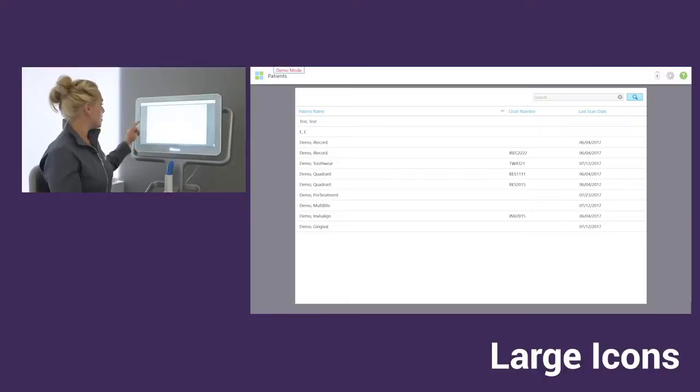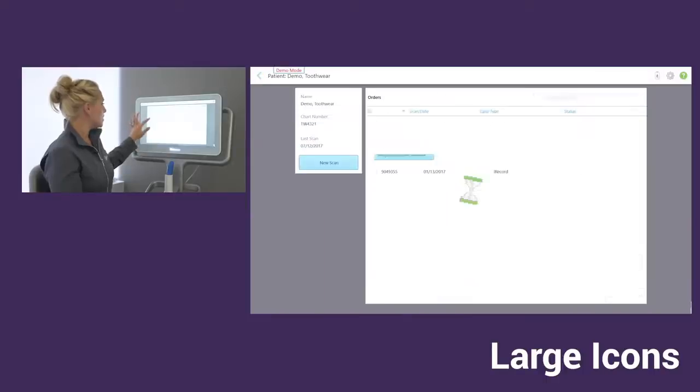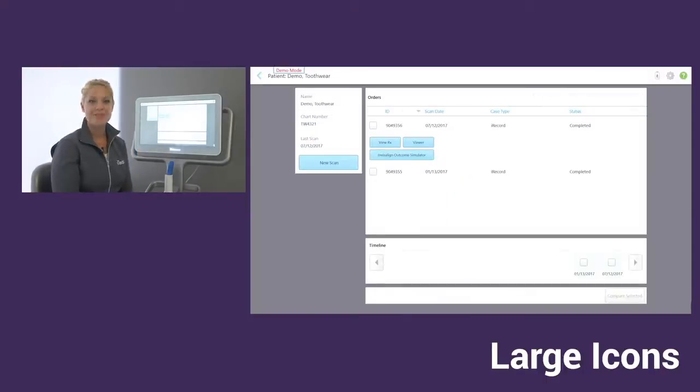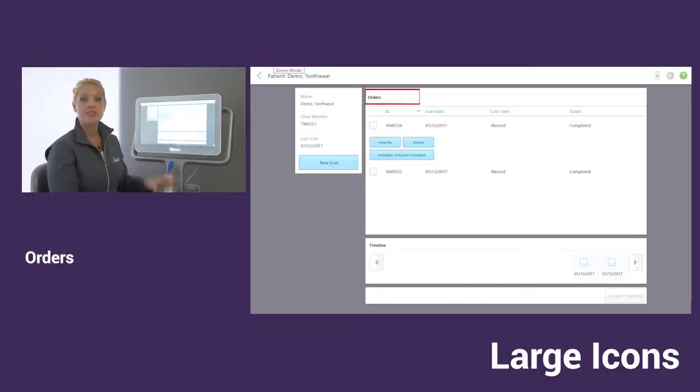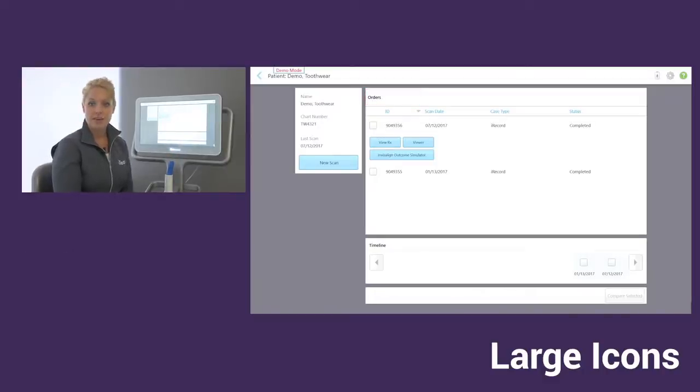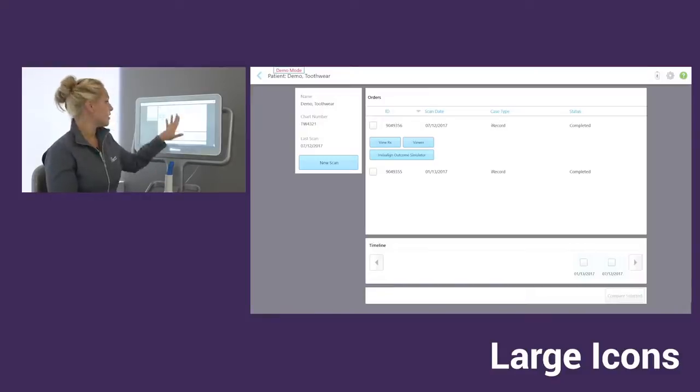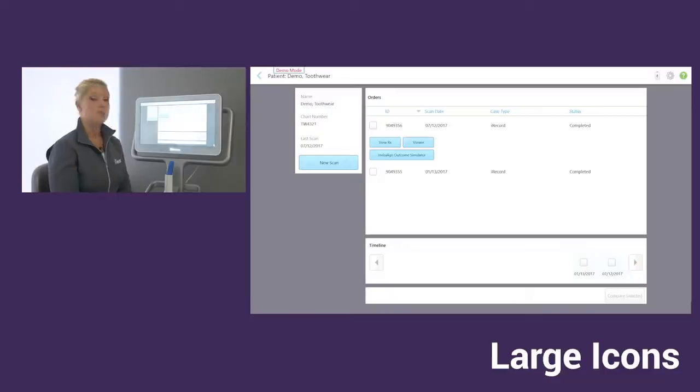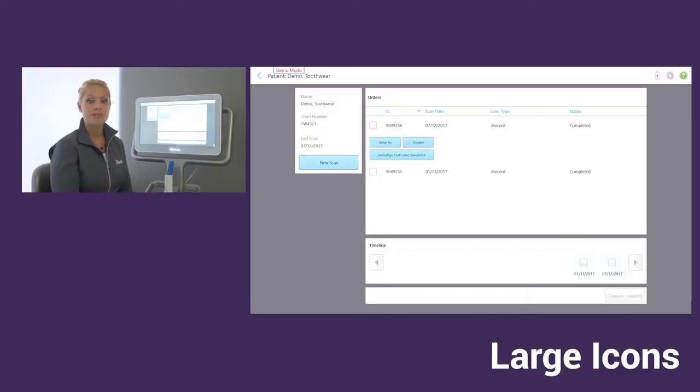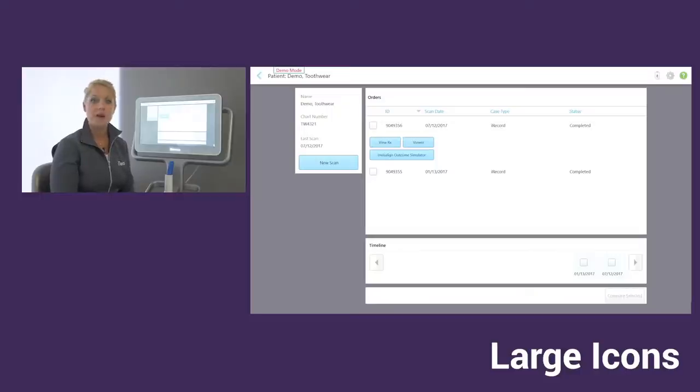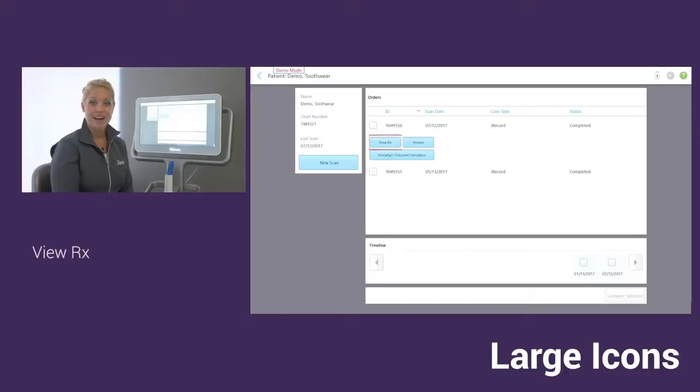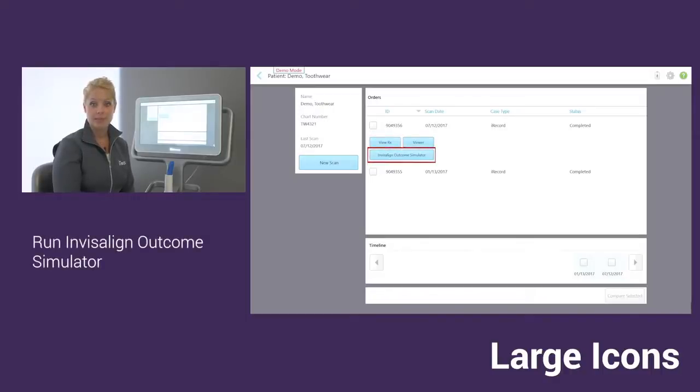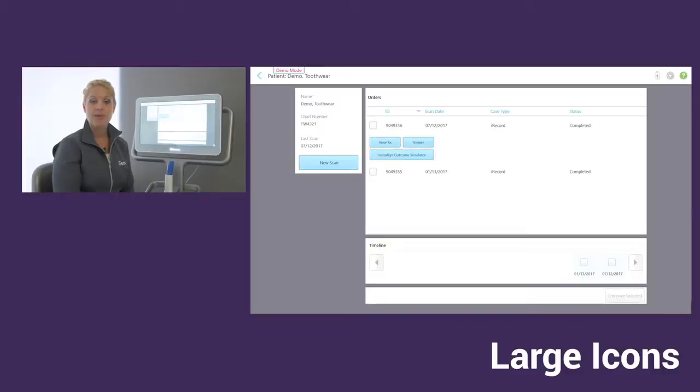For example, we do have our patient. I'm going to go into our demo tooth wear patient. Now we're in their folder. And over to the right, we have the orders. All scans that you've started and sent for this patient will be listed here in the orders area. With each order, you have multiple options. For example, if you scan a patient for a full arch scanning like an iRecord or Invisalign, Invisalign plus iRecord, you'll have the option to view the RX, view the model. You can run the Invisalign Outcome Simulator. We also have the option to run the progress assessment and the addRx feature as well.